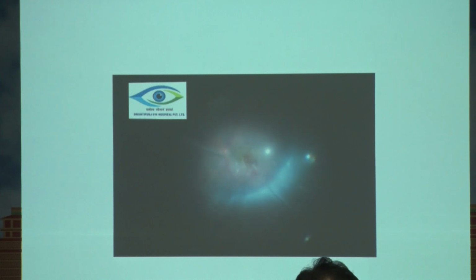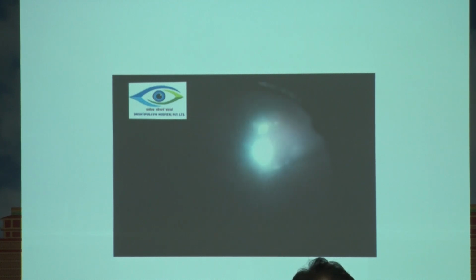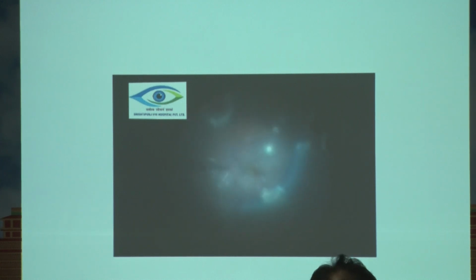The technique was a little bit challenging, as I was trying to do it unimanually. If we switch to bimanual surgery, I think the graft's negotiation would become much easier by using a chandelier light or something. So we freed the flap of retina from the adjoining retina, and that flap was held with aspiration. Cutting was switched off, and aspiration of the cutter was used to bring that flap over the macula. Then we put the flap over the macula and tucked the edges around the whole large hole lying over the macular area.